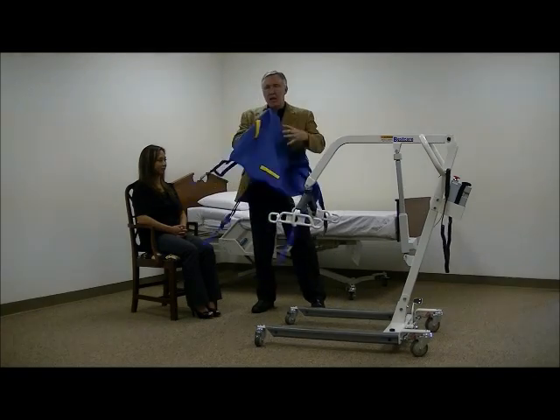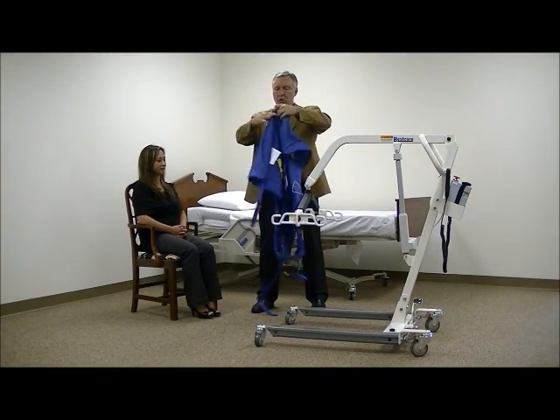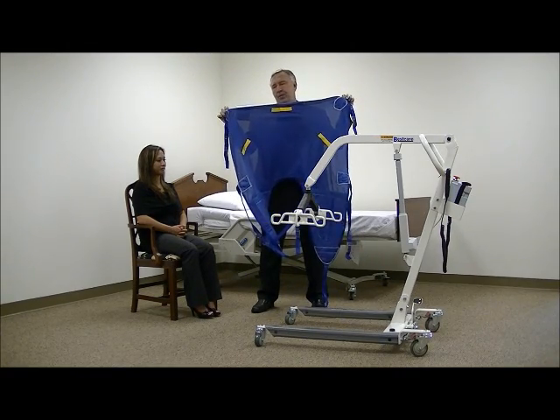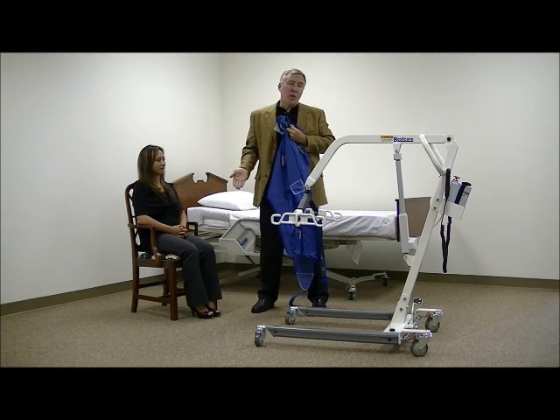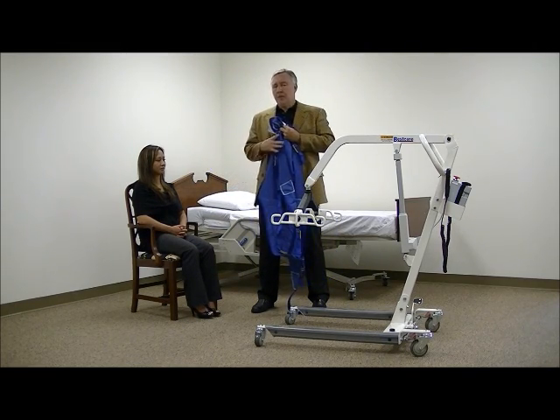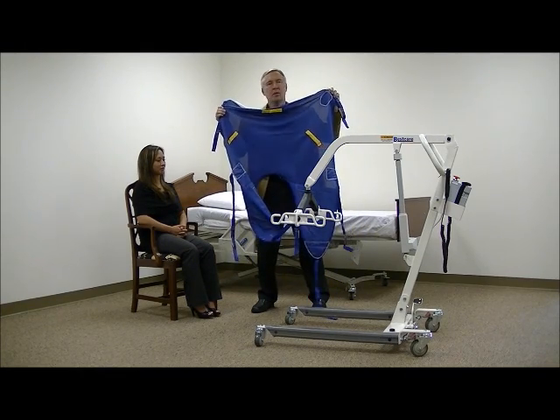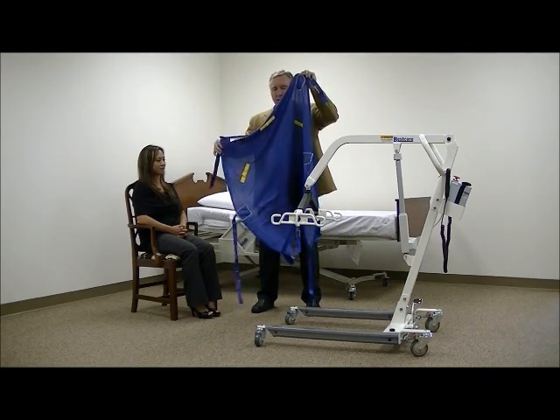Now we need to understand how to use the slings with the lifts. I'm going to start off with the most common sling, which is a universal sling. And you can see it's shaped kind of like a horseshoe. That's designed that way so that we can place it around the patient while they're in the chair without the need to lift them. This particular version is a medium, where it's available in anywhere from small to extra large. So we can cover all kinds of weight ranges.